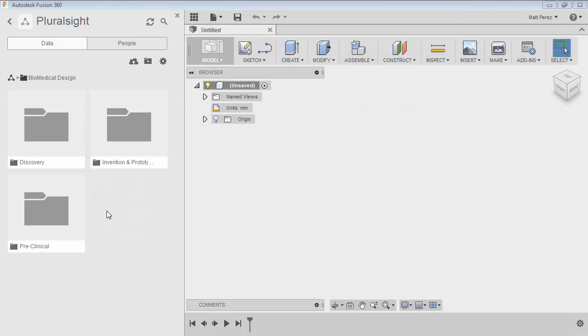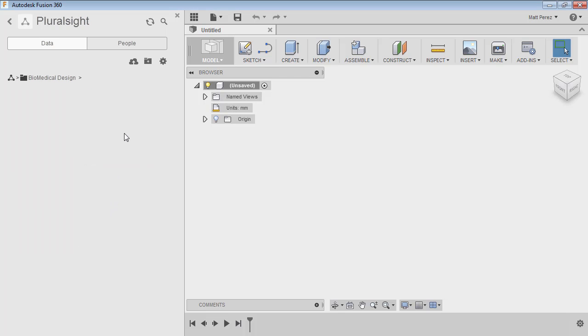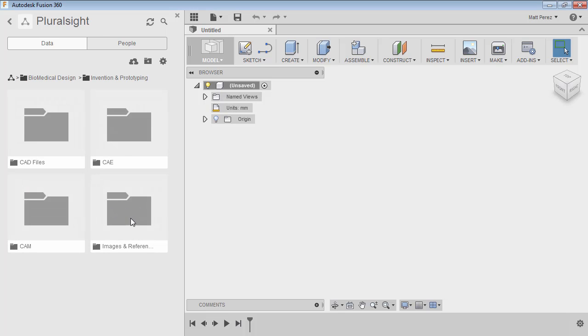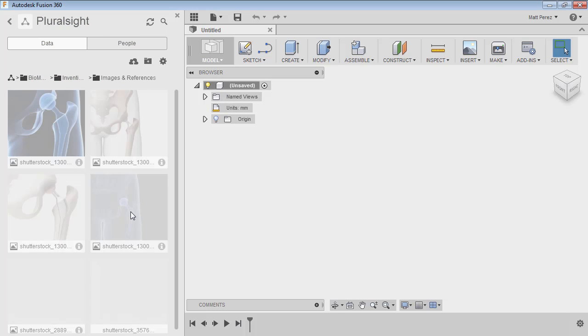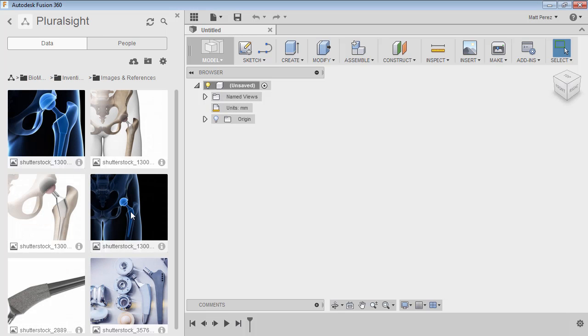We have our biomedical design folder that Chris has created. Inside invention and prototyping, we have images and references. These references are several images that were sent to us for different types of designs that we can possibly create—some good references and a good base direction for what we need to do.